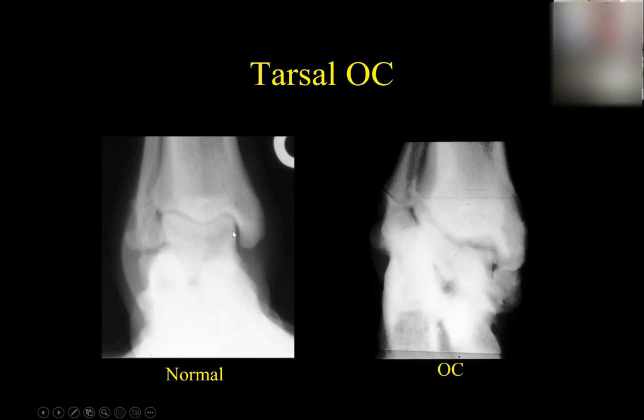And that's because this part of the medial trochlear ridge of the talus broke off and is not there. It fragmented away. Okay, it's not really fractured. It just never did form right and it disintegrated. So it just kind of fell apart. Okay, so that's a typical osteochondrosis lesion. And again, in the tibial tarsal region of the hock, it's super common, for whatever reason, in Rottweilers and Labradors.